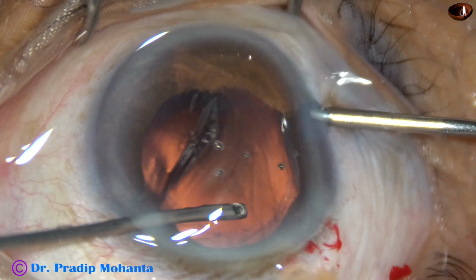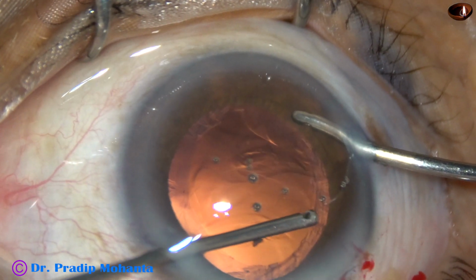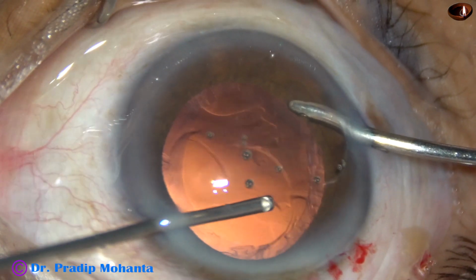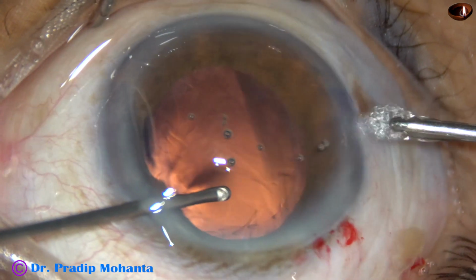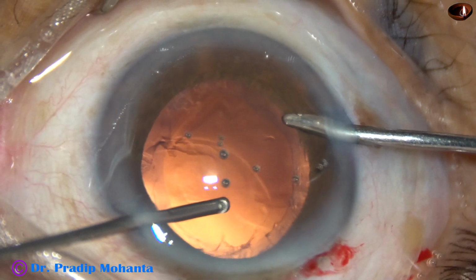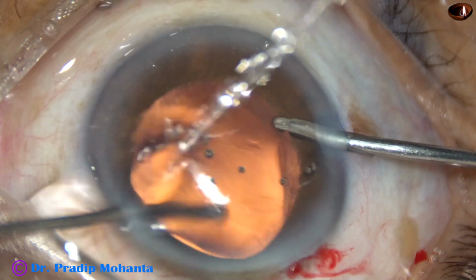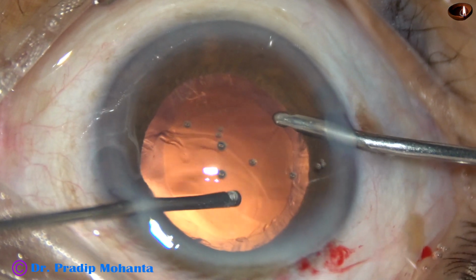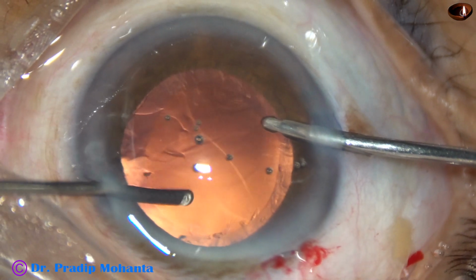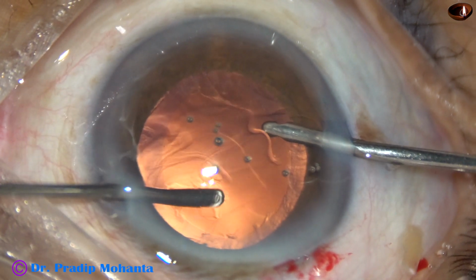Yes, I have been able to remove this piece, and now some more vitreous has prolapsed through the main wound, so I am going to use the cutter here and cut the strands at the level of the anterior capsular rim. I must take care not to cause damage to the anterior capsular rim, because I am going to place a multipiece intraocular lens in this case using this anterior capsular rim. Yes, now vitrectomy is going on very nicely.